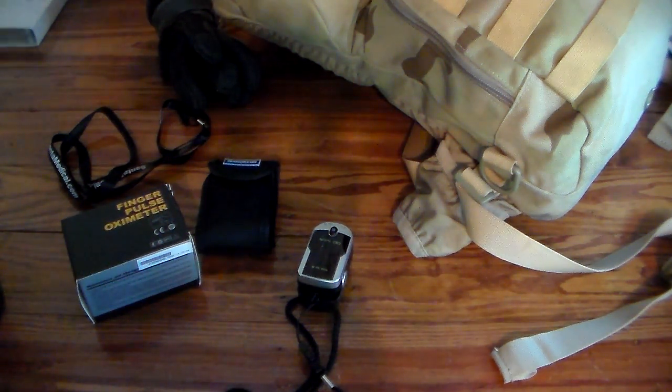Hey YouTube, this is SouthernPrepper1. Today I want to bring you a very vital piece of equipment for medical. This could definitely be used for preppers in a grid-down situation. It could also be used for everyday use. When you get one, you'll realize what did I do before I had this cool little tool.